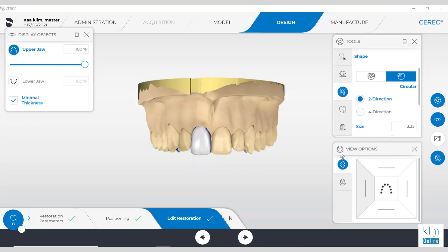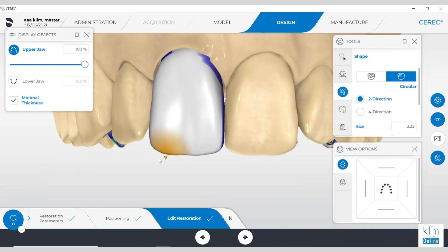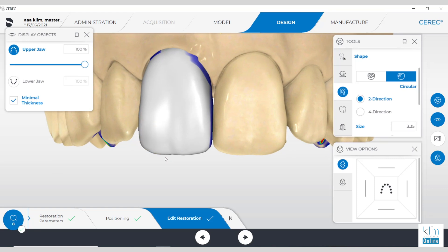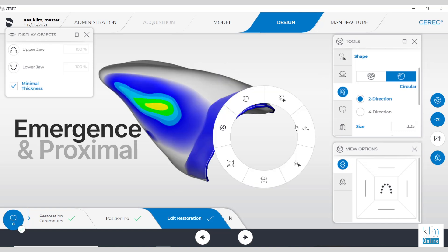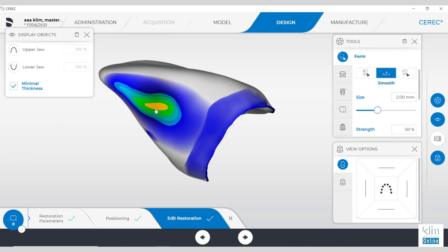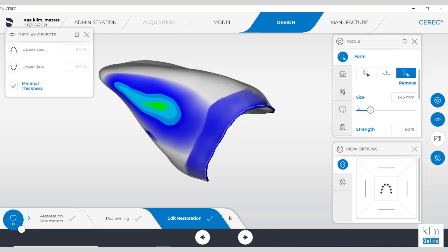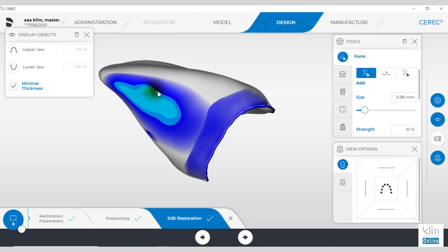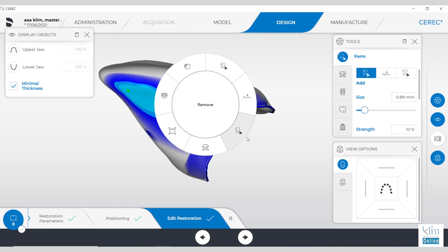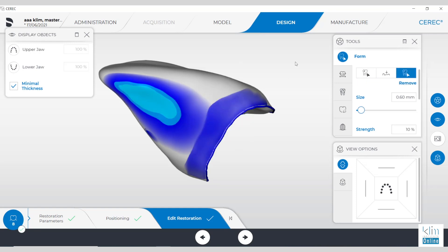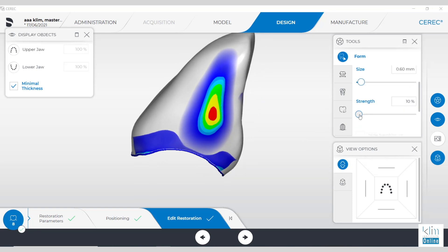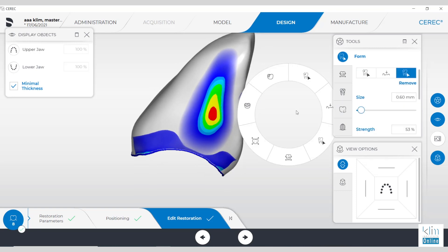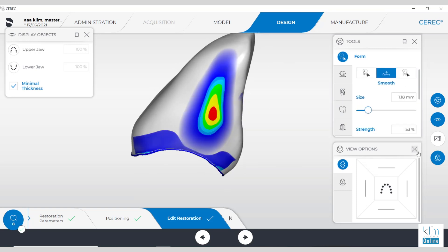Reset our model axis using the view options. Subtle refinements as needed. Then the last step is to check emergence and proximal contacts. Here we want aqua for e.max with fine or extra fine mill. Use the smooth and the removal tool at 10% so it doesn't divot that interproximal surface. For proximal contacts, I often toggle back between the smooth and the removal. At smooth, it's about 50% strength — it flattens the contact. For subtle refinement, go to the removal tool at 10%. Keep those two numbers in mind.